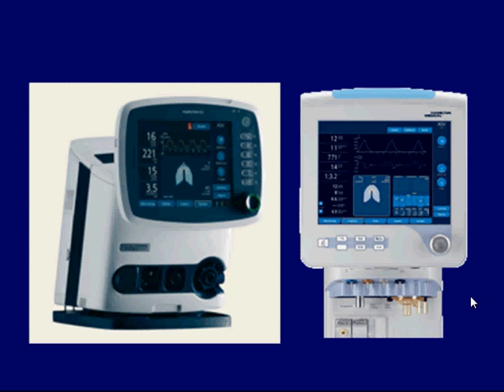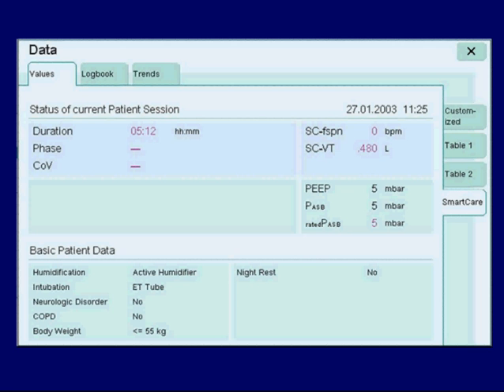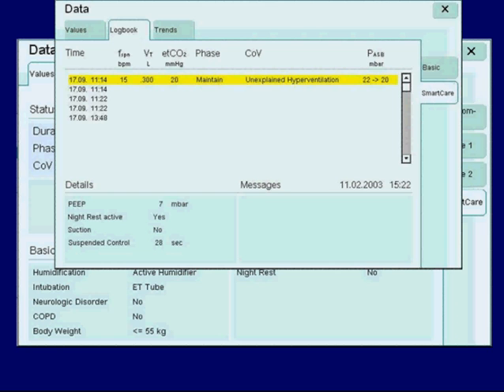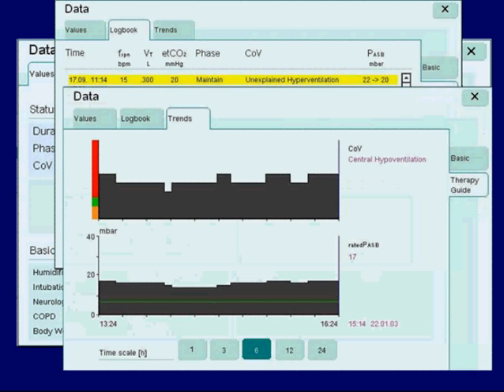What it does is it provides patient information — specifically ventilatory status and the patient's lung mechanics — all in one place. What's nice about this is I don't have to go to multiple screens, for example a values page, a logbook page, or a trends page. It's all in one area.